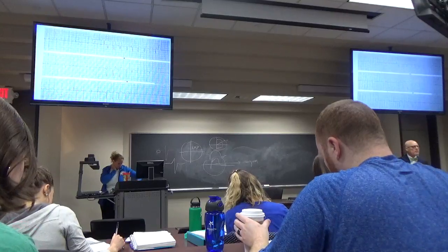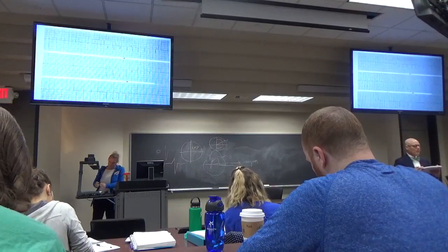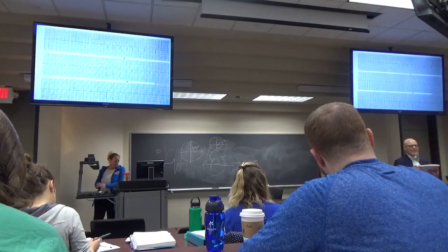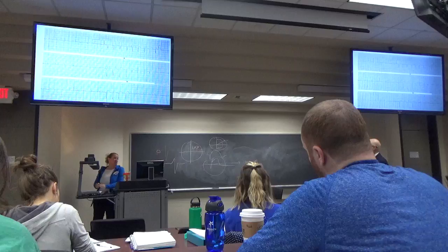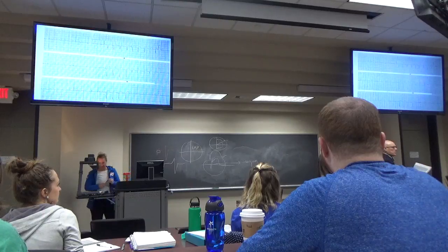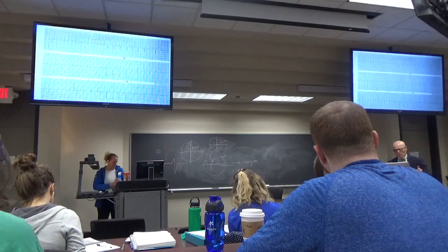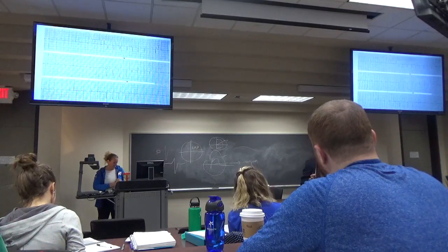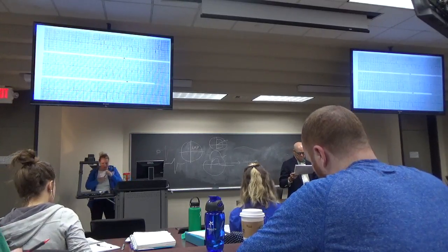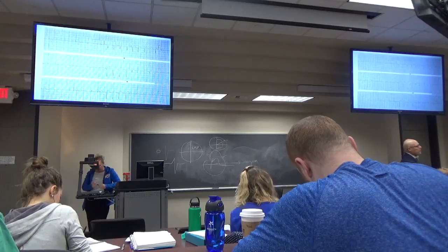Did everyone get a sinus rhythm on this? No. There's a note at the front, up on top, that someone wrote, atrial fib has replaced previous rhythm. That's what I wrote. Someone who read this EKG, I got these out at the heart station, says atrial fib has replaced the previous rhythm. The right bundle branch block is no longer present. But you don't have a previous to compare it to. But this is atrial fibrillation. So if you map it out. Okay, so it's atrial fibrillation.